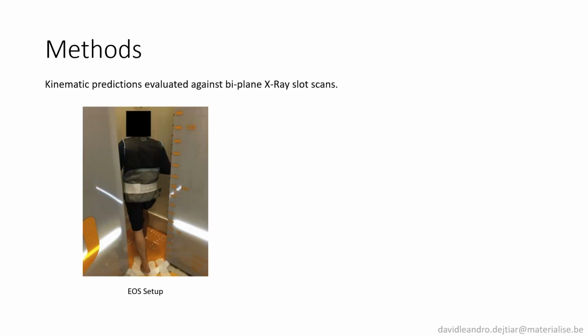To evaluate the model, we used measures of rotations and translations reconstructed from biplanar X-ray scans. The X-ray scans were taken with the EOS scanner, which allows to take X-ray images at weight-bearing positions.